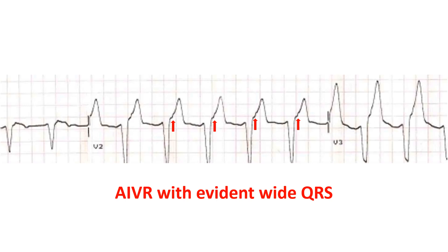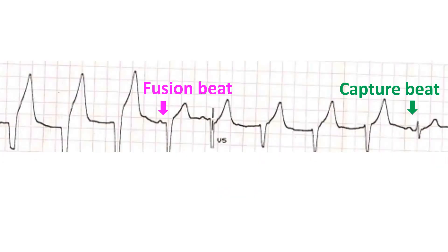In this tracing, the wide QRS is quite evident. The P waves are not very evident, though careful examination will reveal the slight notching of the upstroke of the T waves. The 4th beat shows a P wave with reasonable PR interval and a QRS which is narrower than the initial 3 beats, suggesting that it is a fusion beat.